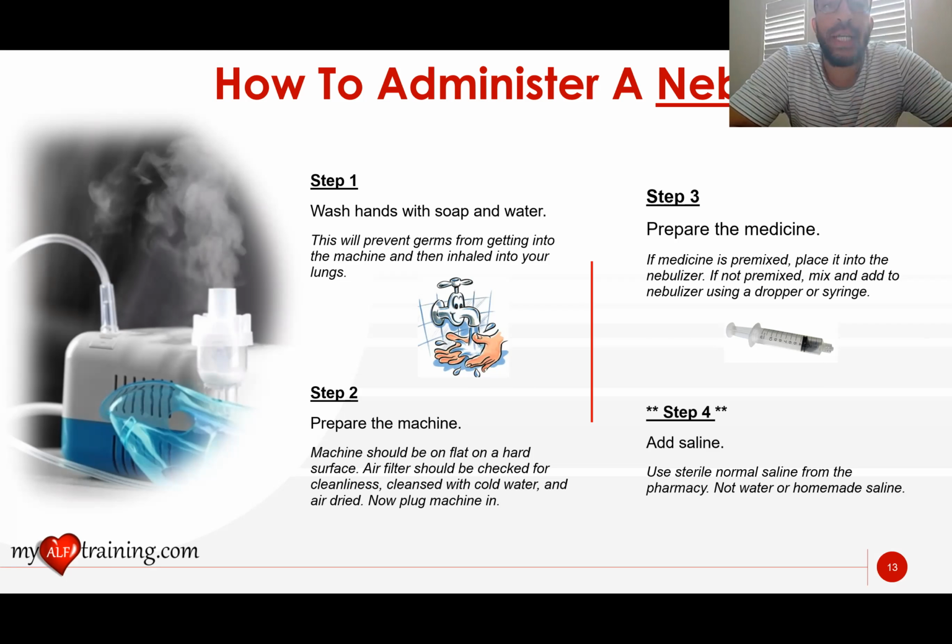And we don't want any bacteria on our hands to also travel with the medication directly into the patient's lungs. So we want to make sure that we wash our hands with soap and water, put on gloves, and we don't touch anything before we touch that medication chamber and are ready to put the medication into the chamber.